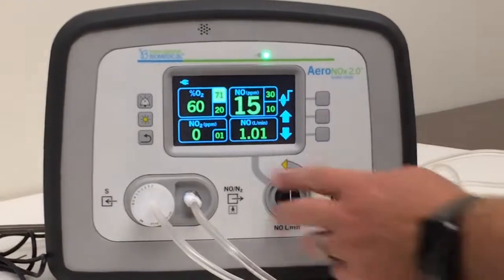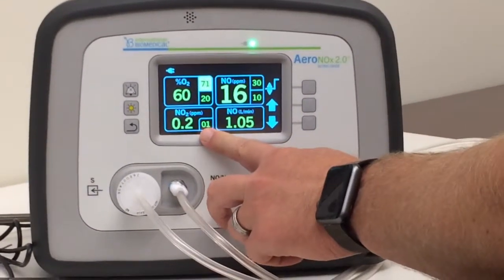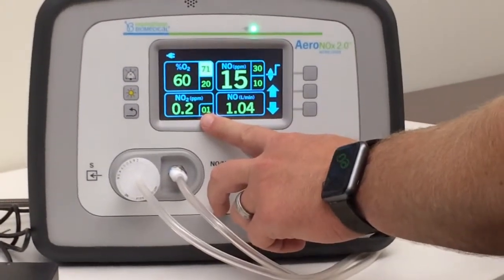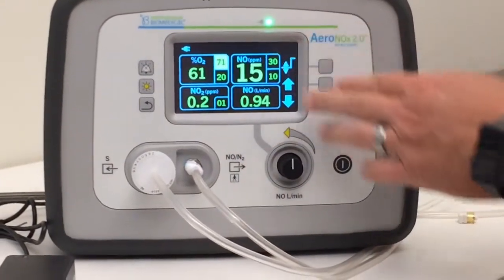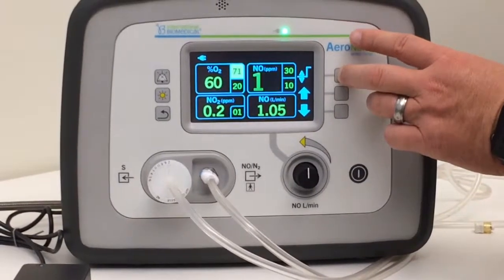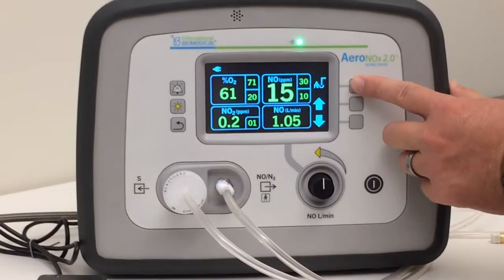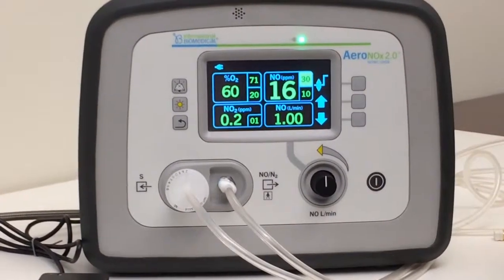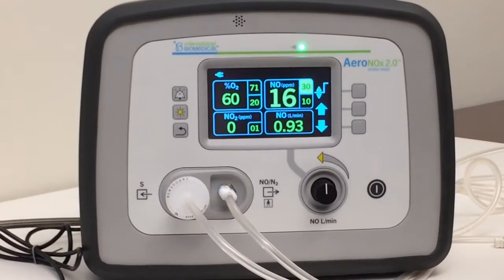That's basically it. We'll want to be monitoring the NO2 over here — one part per million is your high limit alarm. Some important things to know: on the high limit alarm for the NO, if it gets five parts per million above the high limit alarm, then it goes into a mode where it shuts the nitric off. That's a safety mechanism.